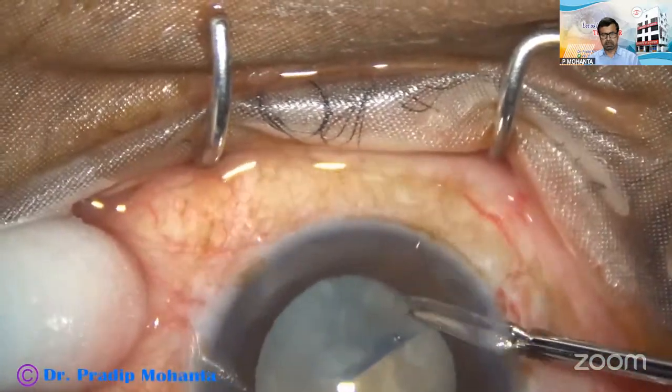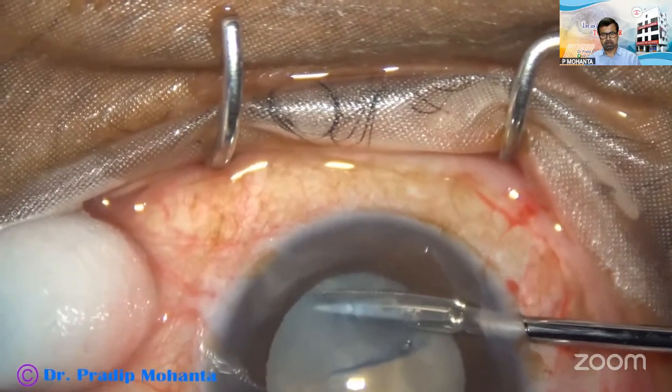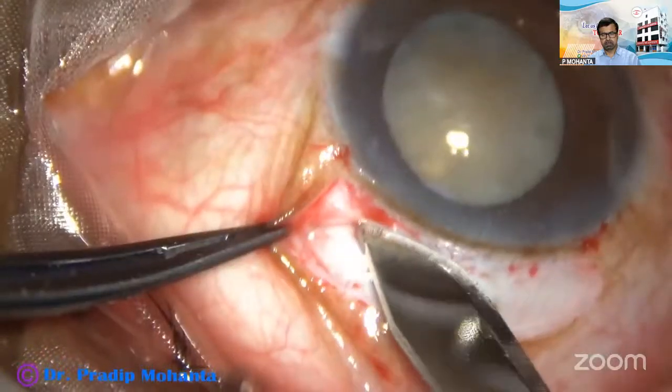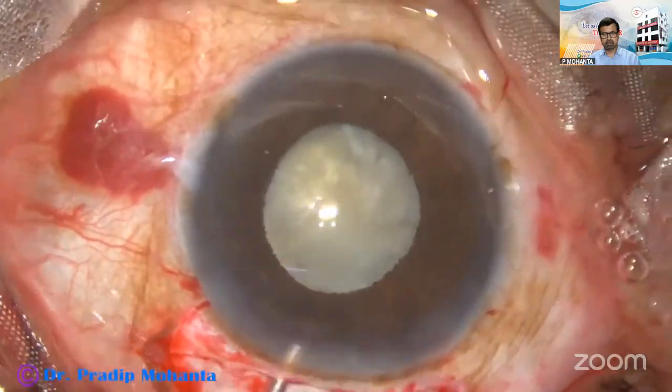So if I try to pull it, I can detach the zonule. It can cause a lot of damage. So I take a micro scissor, cut the capsule, complete the rhexis, and convert to SICS.